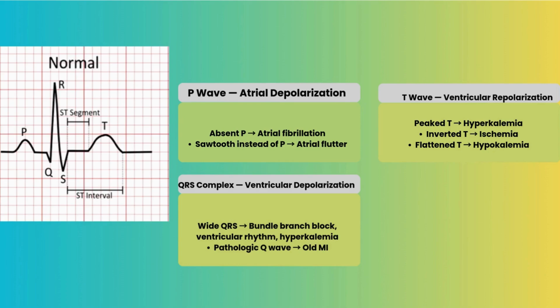The EKG machine will capture the electrical current moving across the heart and give us something we can see and work with. In a normal working heart and rhythm, one beat signal should look like this. One beat includes a P wave, QRS complex, and a T wave. P wave represents the atrial depolarization, the electrical current flowing through the atria.